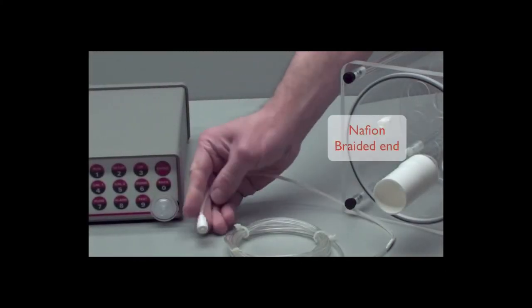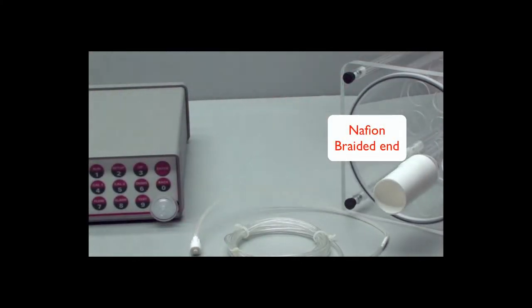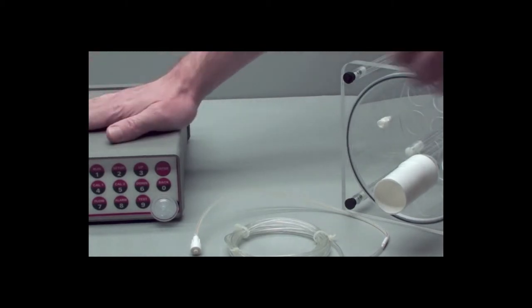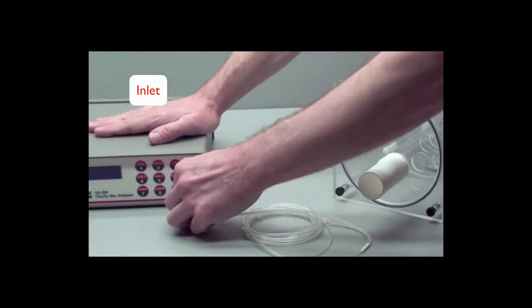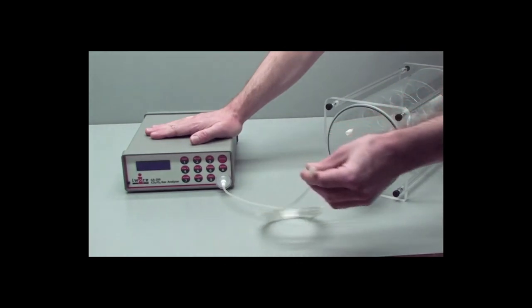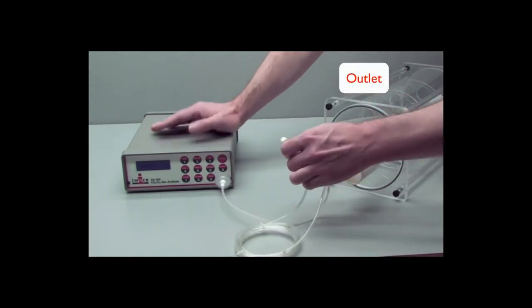Next take the clear Nafion tubing, and take the braided end, and that goes to the front inlet of the gas analyzer. The other end then goes to the outlet of the mixing chamber.